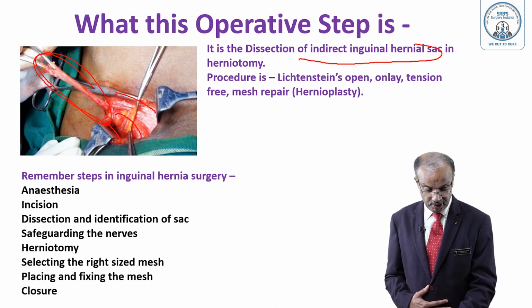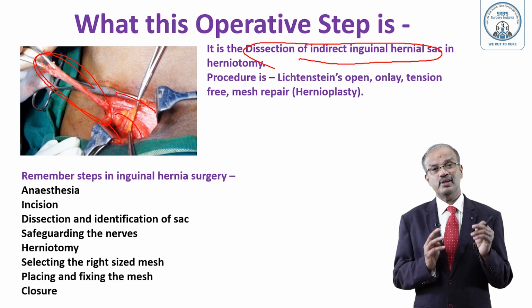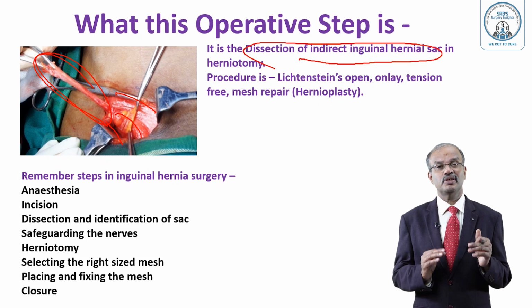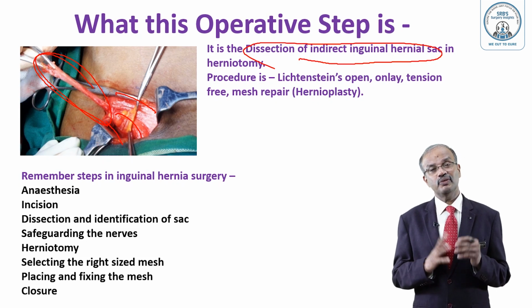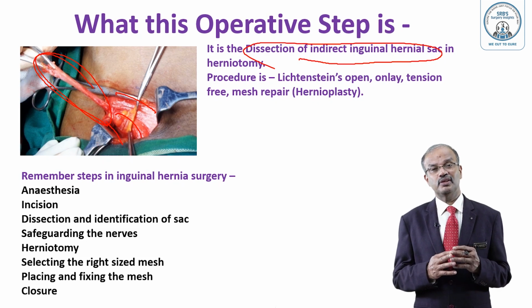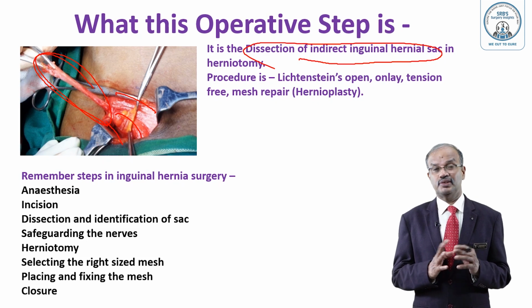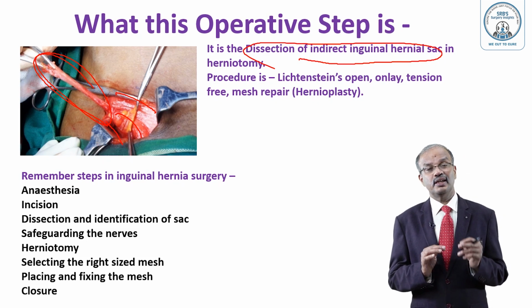Typical inguinal hernia sac. So usually either spinal anesthesia or general anesthesia or local anesthesia. In Western countries, the commonest anesthesia used is local anesthesia, otherwise general anesthesia. In other countries like us in India, we commonly use spinal anesthesia and often local anesthesia. And children always get general anesthesia. After cleaning and draping, the incision is just above the inguinal ligament, medial 2/3, 1.25 cm above.